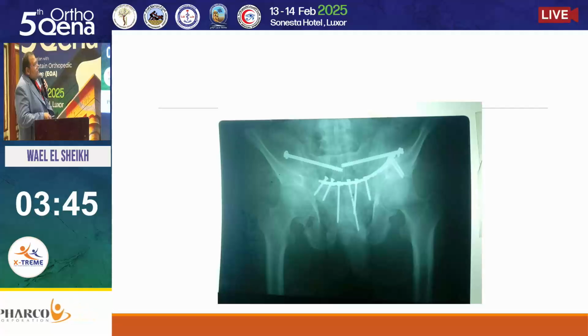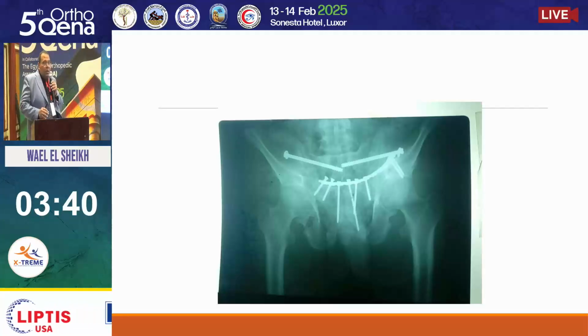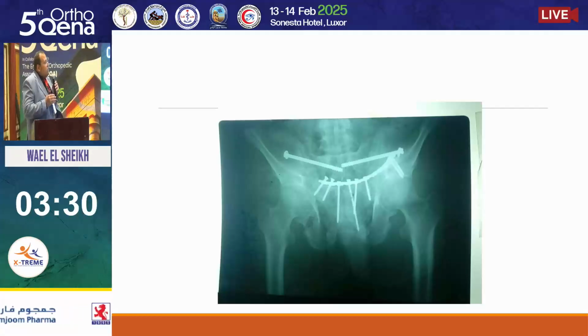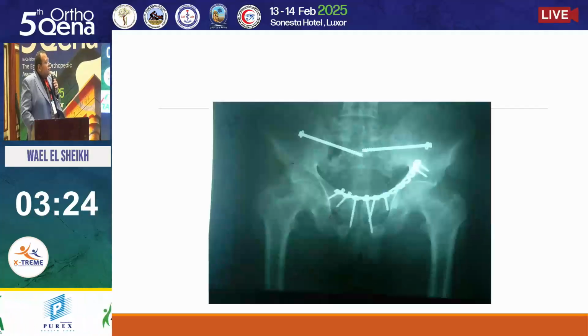There is impaction of some screws. This is due to the nature of the symphysis pubis, which is a slightly mobile, fibrocartilaginous joint, and rigid fixation is not suitable for it. So every now and then screw impaction or breakage may occur, but with no revision rate.